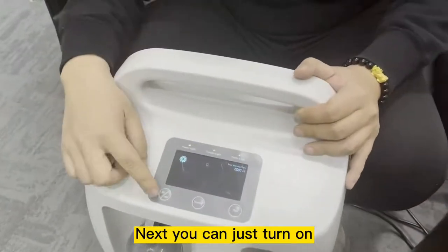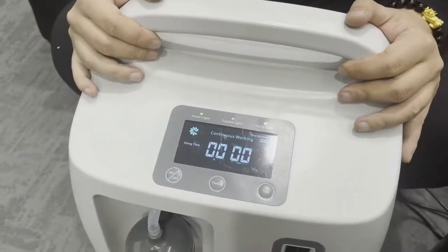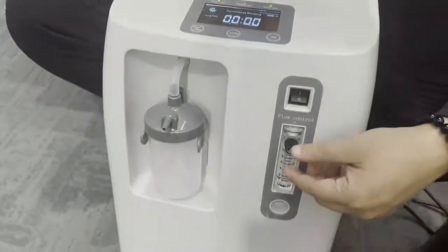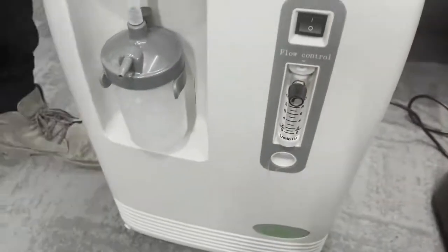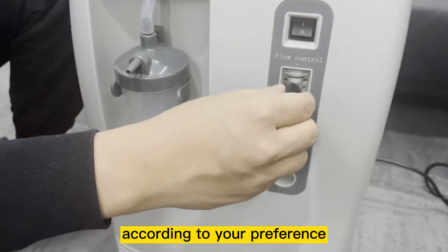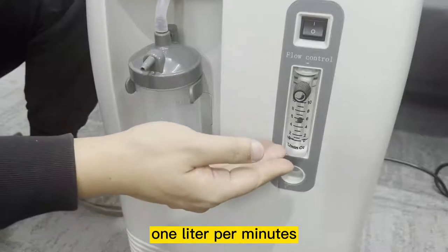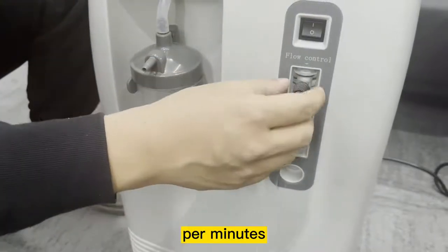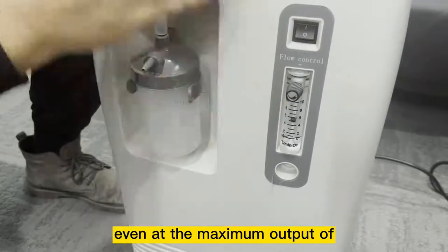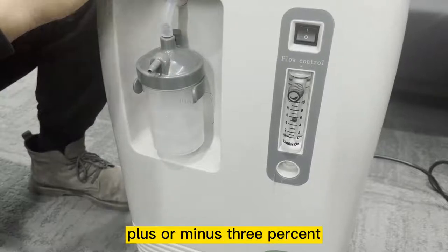Next, you can just turn on the machine and the unit will start operating. Our OLV-10S also comes with a mechanical flow meter — you can adjust the flow rate according to your preference. This model allows you to adjust between 1 liter per minute up to 10 liters per minute. This is a medical oxygen concentrator, so even at a maximum output of 10 liters per minute, the oxygen purity will remain at 93% plus or minus 3%.